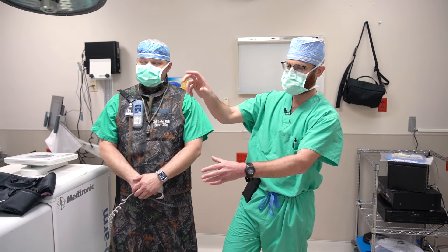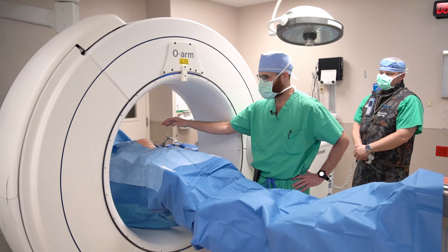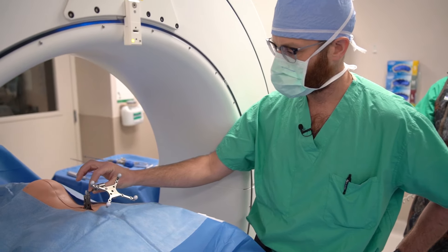We have our O-Arm set up. Here is our patient. We want to avoid making a massive incision — a very disruptive and painful incision. So we've affixed this fiducial to one of the spinous processes.